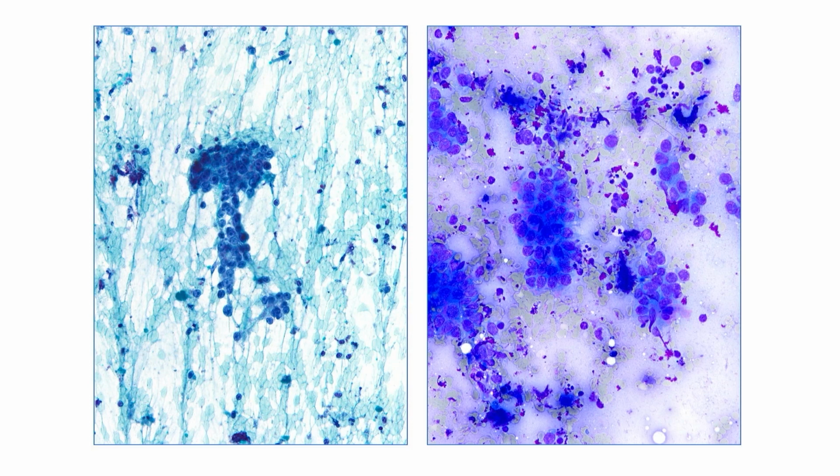So now you can see the cells are in fragments. You can see the nucleus size and shape, presence or absence of nucleoli, presence or absence of lymphocytes in the background, whether the cells are microfollicular or gland forming, as seen here. And even at this magnification, you can see huge nucleoli in most of the nuclei and a sprinkling of lymphocytes in the background. So I think we have enough for the diagnosis.